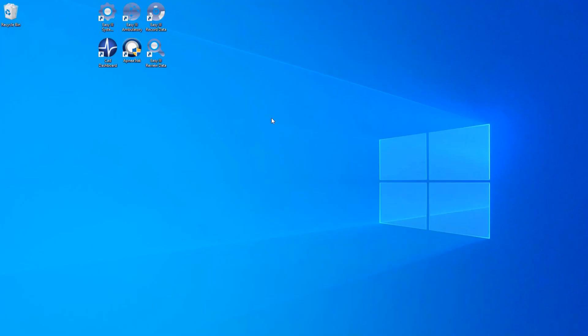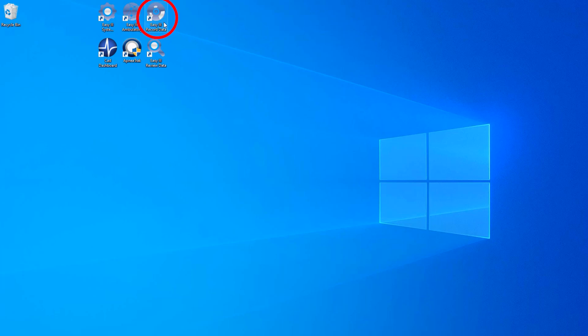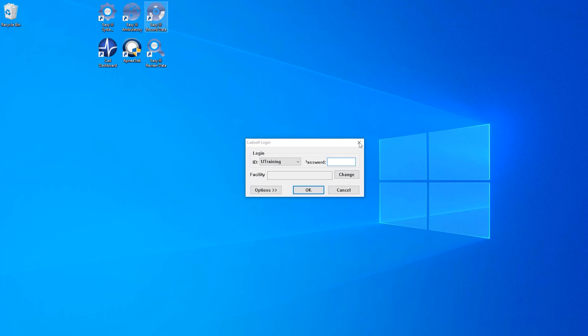In this video we are going to discuss how to start a recording for a sleep study using the EZ3 system. On your desktop you will find the application icon for EZ3 record data. Open the application to launch the dashboard.